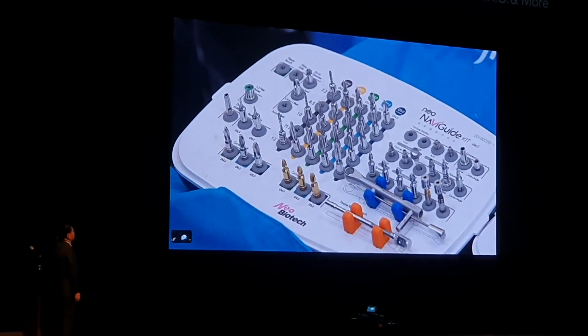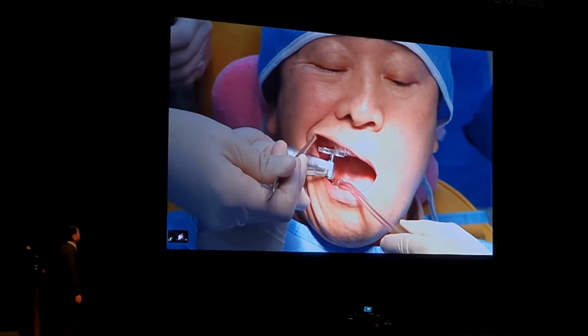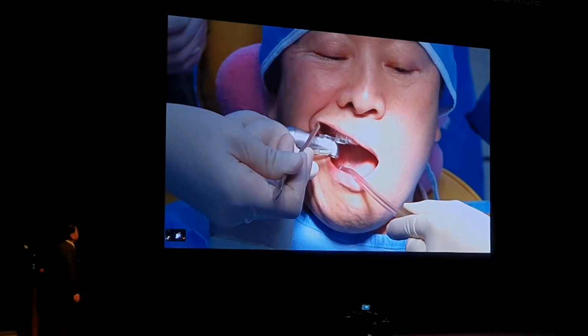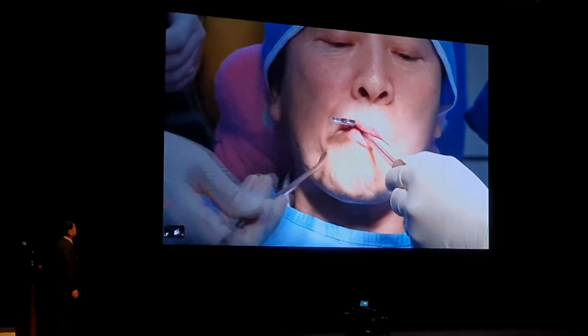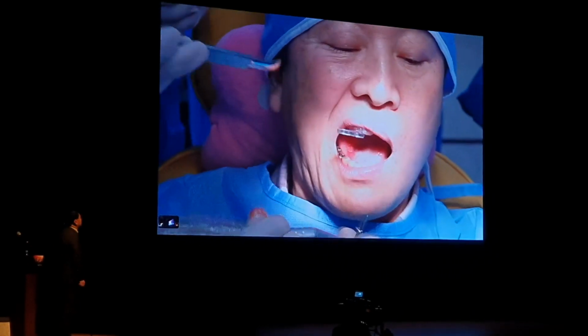He just did his own suction. The 2.2 by 11.5 mid drill is being used. So this makes 11.5 minus 3, approximately 8.5 millimeter length of the drill. I think you should relocate the tray once more. So it is now drilled up to 2.2 by 8.5 millimeter.